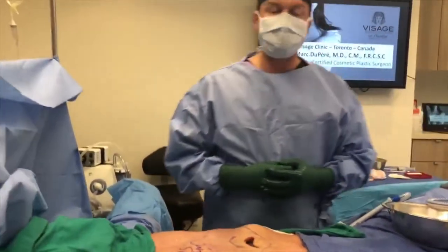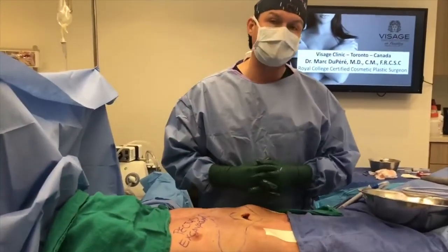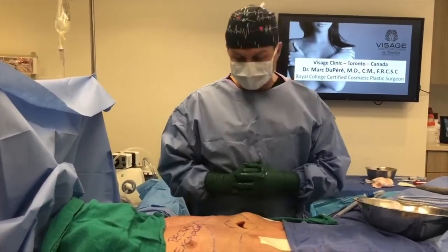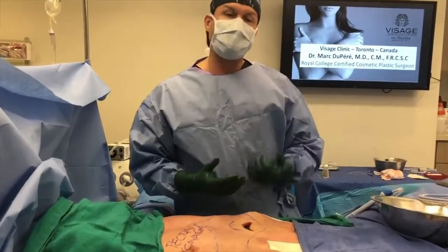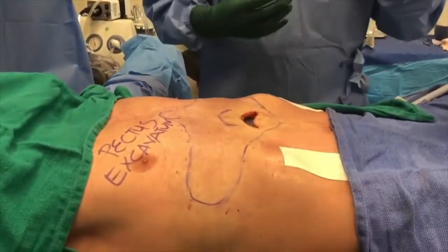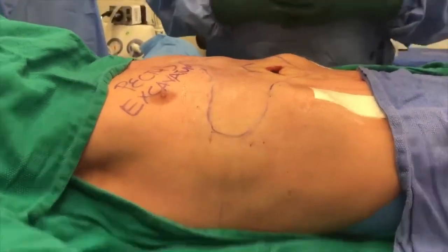This is a procedure I have been performing here in Toronto for 17 years. So I started in my first year of practice back in 2001. This implant is made for him, so they make only one. It requires 2 visits as a minimum to my clinic. So 1 visit first for the moulage and 1 procedure visit for today.